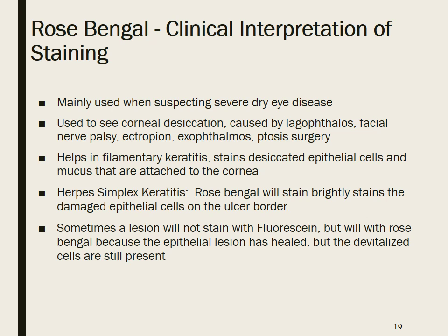And sometimes a lesion will not stain with fluorescein, but will with Bengal, because the epithelial lesion has healed but the devitalized cells are still present.